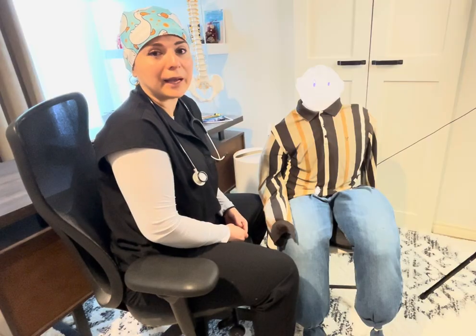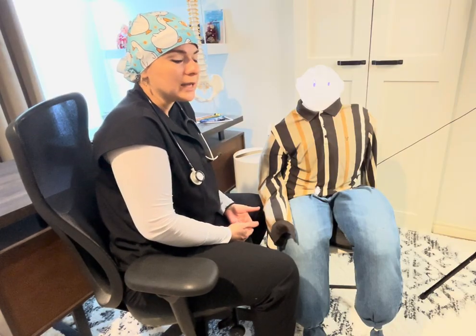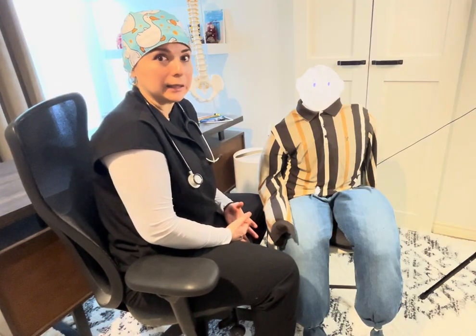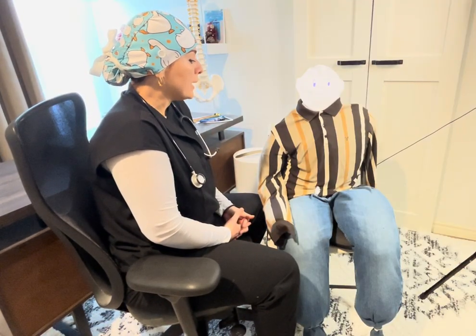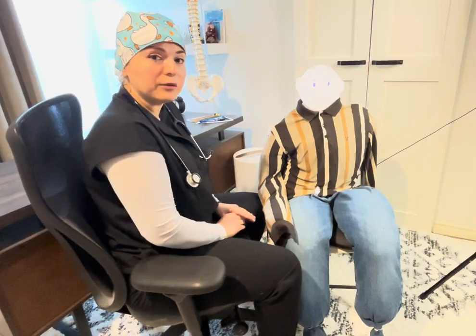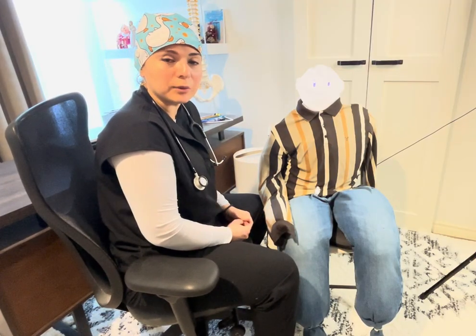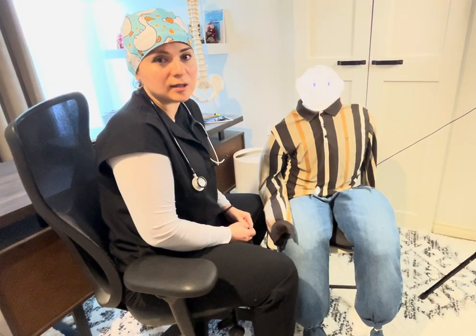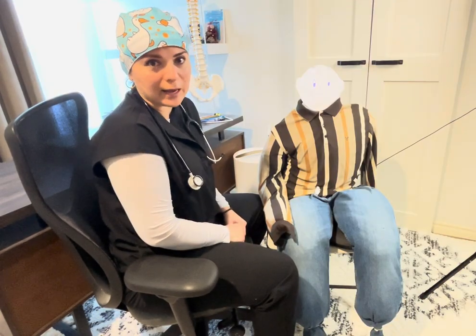When checking the pulse, assess for rate, rhythm, and strength — is the pulse weak, normal, or very strong with a pounding sensation? Then, before checking the actual blood pressure, you need to find the estimated systolic pressure. I'll show you how to do that.